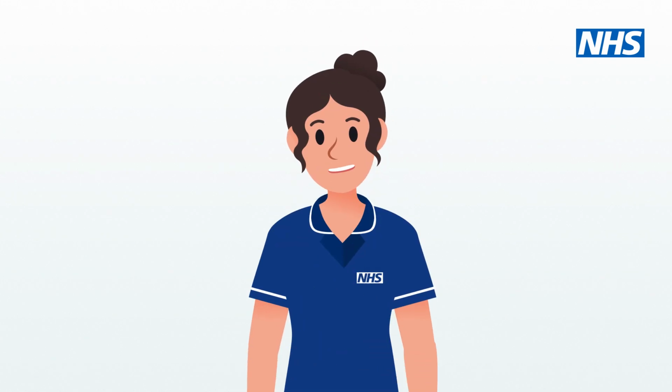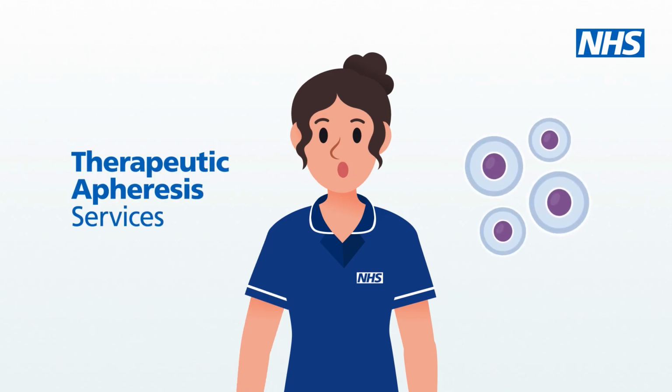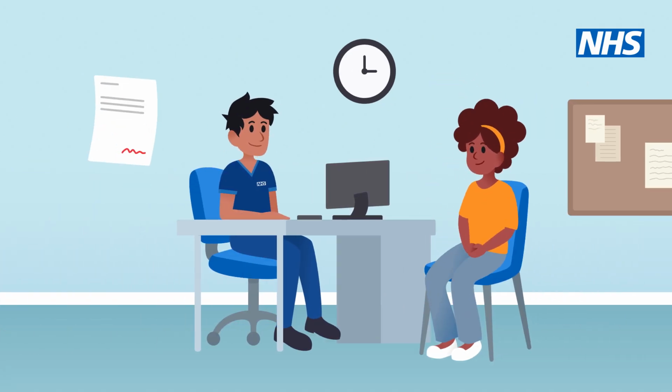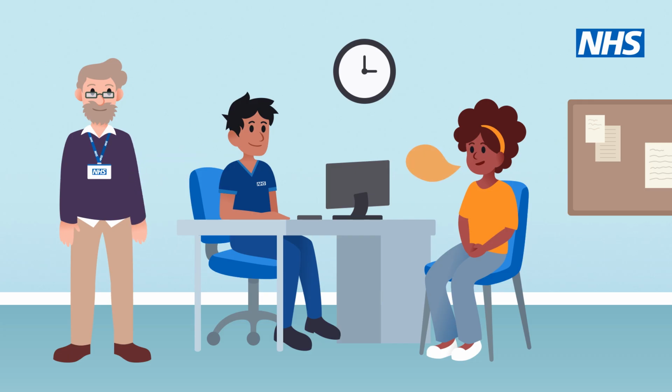This video is to give you information about the process of donating your stem cells through therapeutic apheresis services. Donation is always voluntary. However, if you withdraw consent after the patient has started their treatment, this will have an impact on them and they won't be able to continue their treatment. If you have doubts, please talk to your donor coordinator or medical professional as soon as possible.